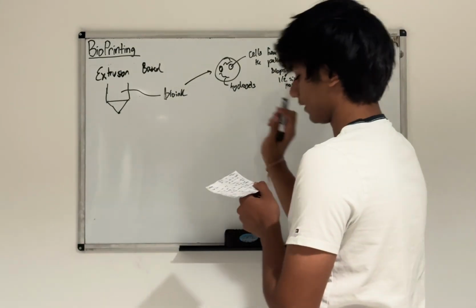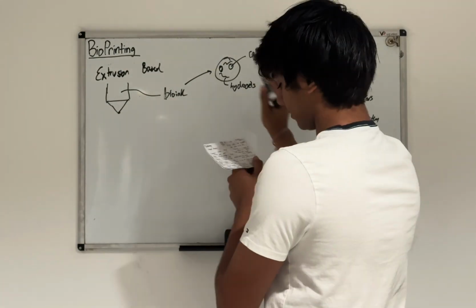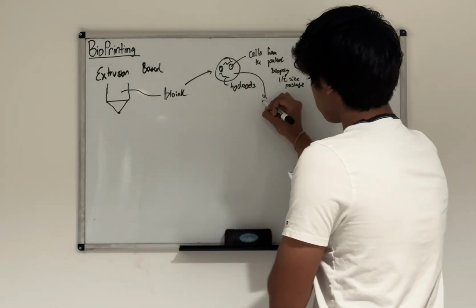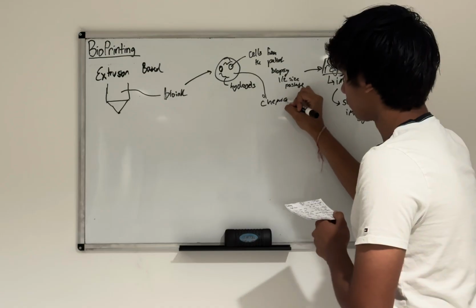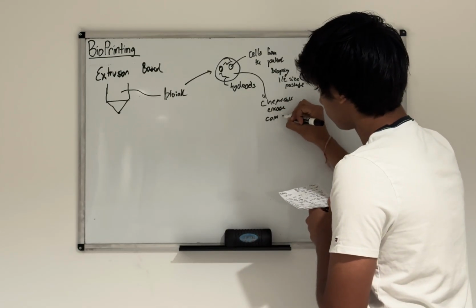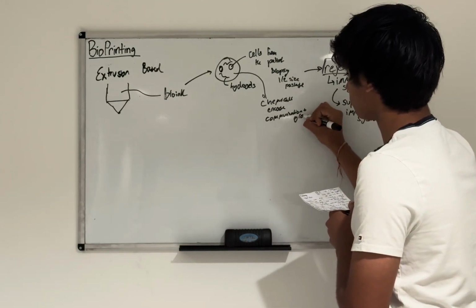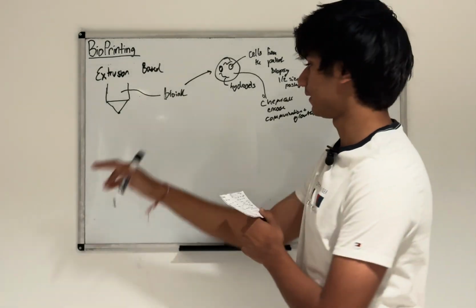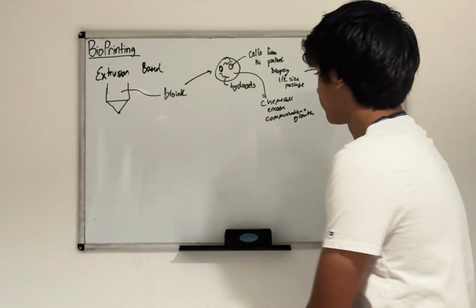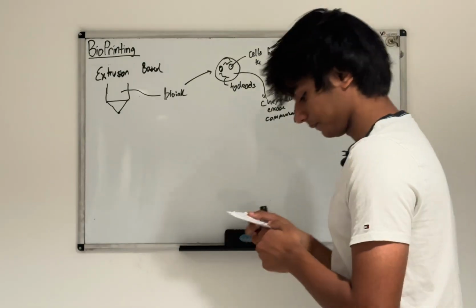So, anyways, back to bioprinting. You also have living cells, and inside this bioink you have these chemicals that encourage communication plus growth. And so these chemicals make the process faster. So when the ink comes out of the platform and lands on the dish, it's able to grow the cells faster and create tissue faster with these chemicals.